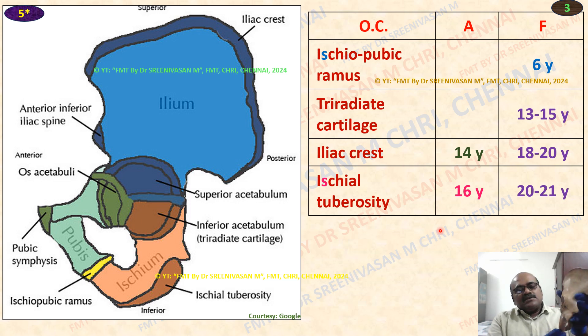Then lastly, the ischium tuberosity. As you are seeing here clearly, the ischium tuberosity is like the iliac crest — a very thin blade overlying the ischium — that appears at 16 years, with fusion at 20 to 21 years. This is the last one to fuse, one year later than the iliac crest. So the ischiopubic ramus fuses first at 6 years.